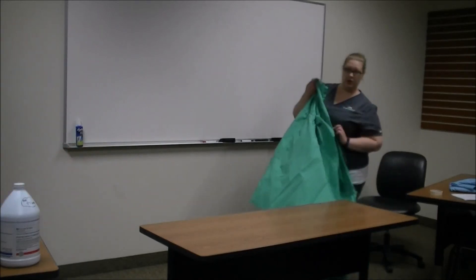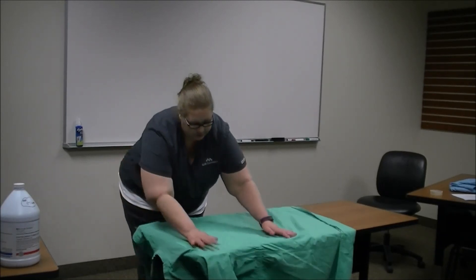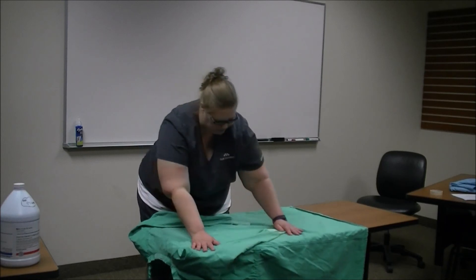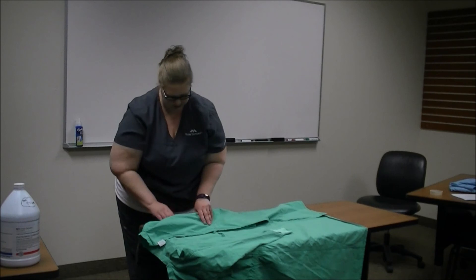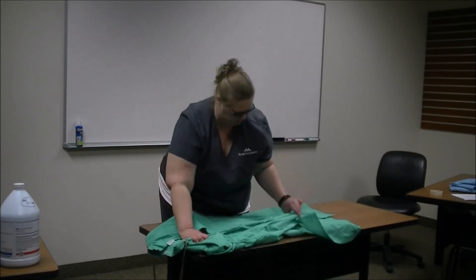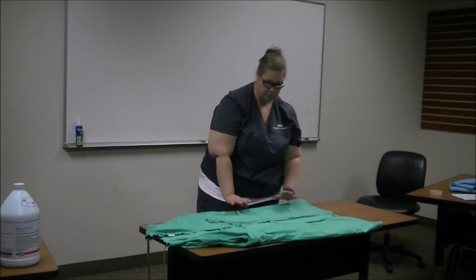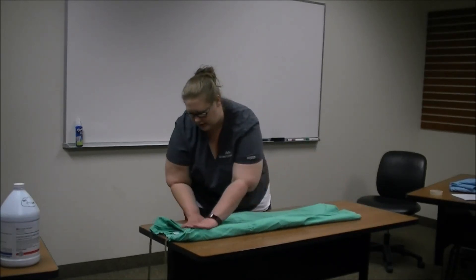I'm going to show you how to fold the gown. First you want to start by having your gown on the table. You're going to bring up your sleeves — you don't want them overlapping each other or touching. You want a line kind of down the middle. Then you bring the back of the gown up and pull that over, not quite all in the middle. Make sure that the armpits of the gown are opened. Do the same thing on the other side, make sure the armpit is tucked in nicely. Then fold it over into the middle and do that on both sides, making sure it's nice and straight.